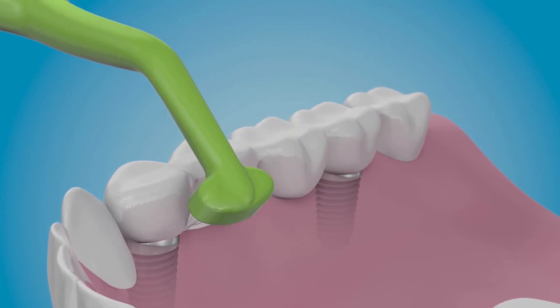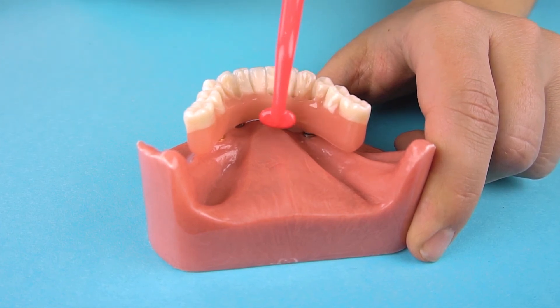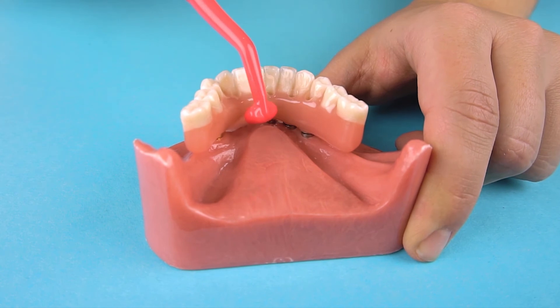This motion also works well for tilted teeth and around cemented retainers. There are two rows of bristles, so a sweeping motion is ideal for under bridges or implant dentures. Thank you for taking the time to learn about our products. Please visit our website for more information.